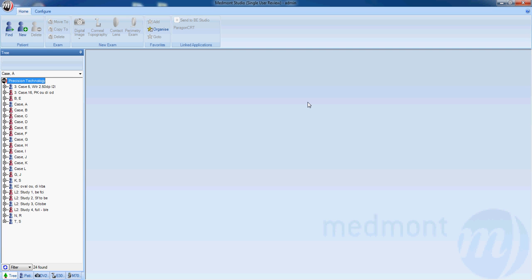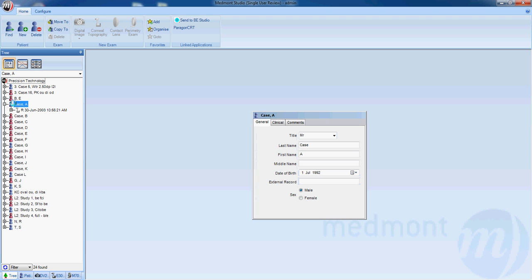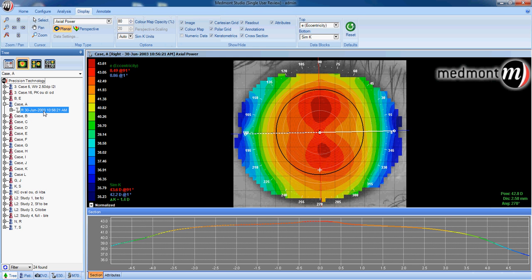This is video six on analysis with your Medmont E300 corneal topographer. Let's start by selecting a patient. We can click once on the plus sign to open up the patient file, or double click the patient name. We can see we have one right topography. Let's select that topography.